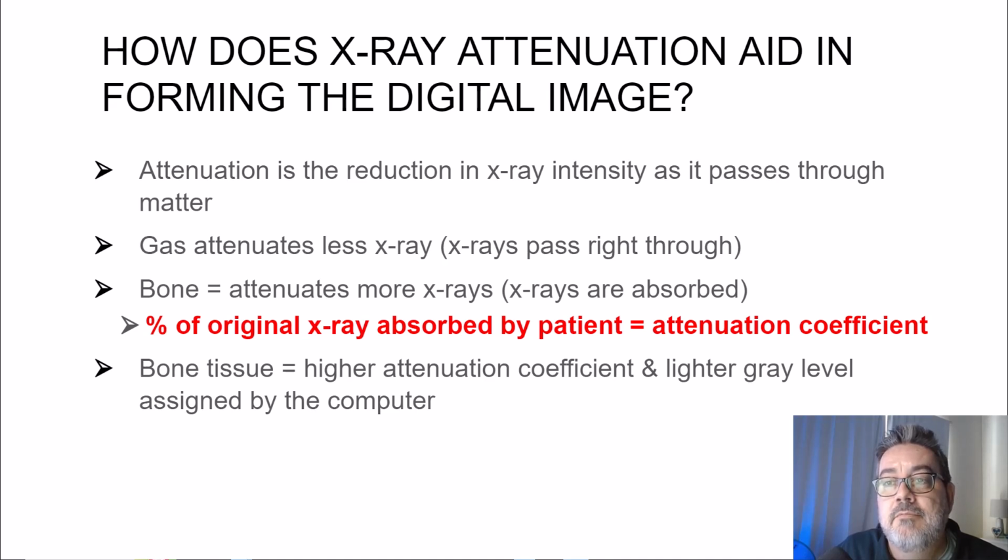So the very minimum you should do is hike up the kVp for the man and be sure to collimate to clean up scatter. That's another thing that you don't see people doing much of these days. I don't mean to get into specifics about technical factor selection too much here. There's a whole other class for that.